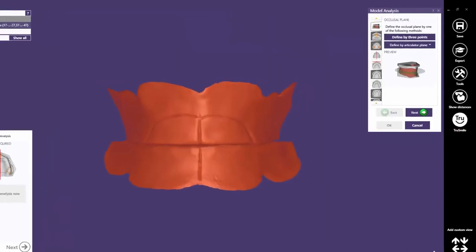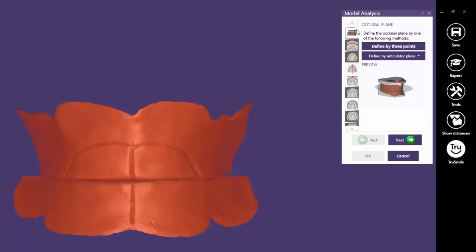The model analysis is the secondary wizard within the main wizard. The work steps of the analysis are presented in a vertical list. This allows you to freely move between the different steps. Note, only the activated dark-colored step icons can be clicked. All other step icons require a previous action to become accessible and appear highlighted. However, the most simple way is to follow the wizard by clicking the Next button.